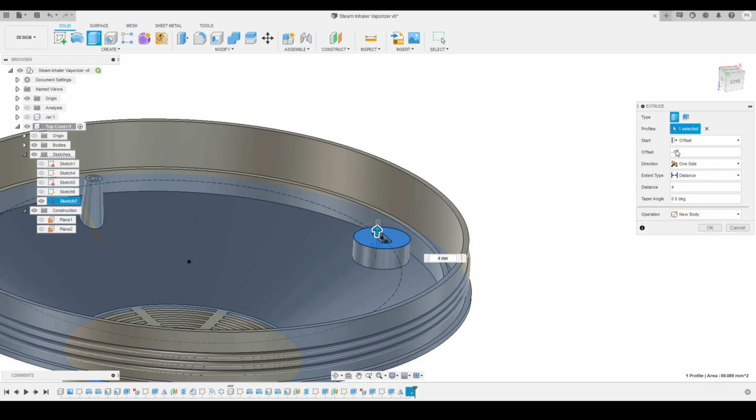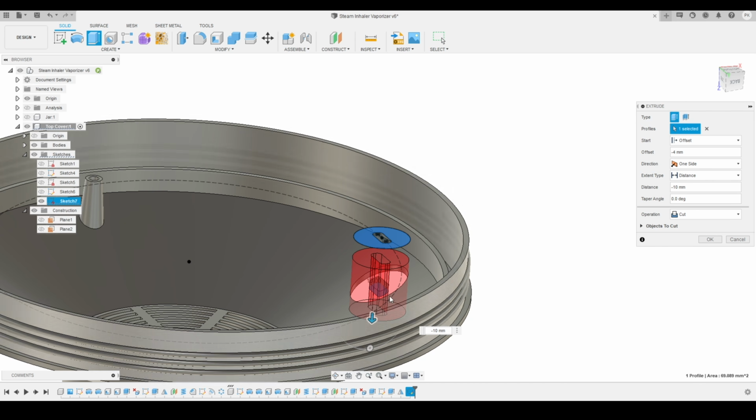So I think I had to increase this offset a little more. So I will just increase that to maybe -5 millimeter, and then I had to increase this by 10 millimeters. So here you can see this is the result we are getting. If I change that to -10, that is working. So I had to adjust these dimensions to get the right distance or the right measurements.